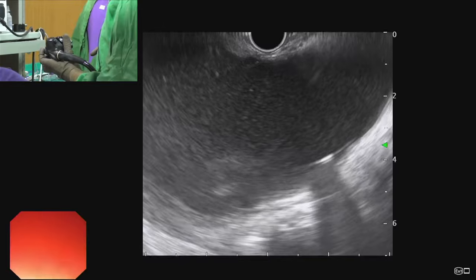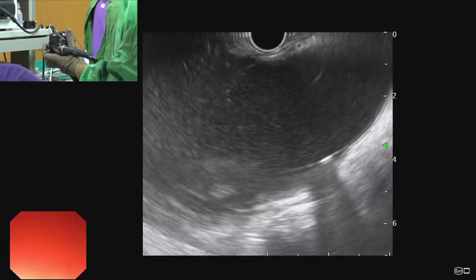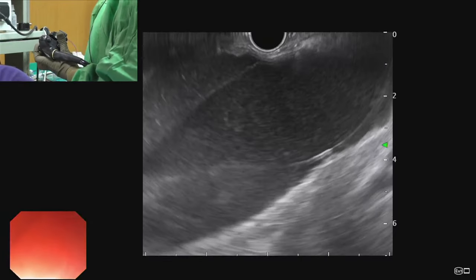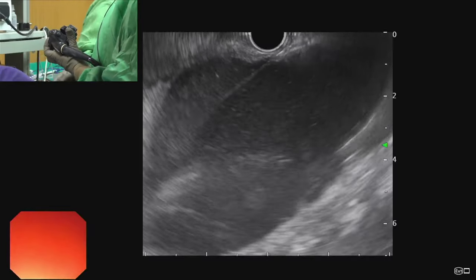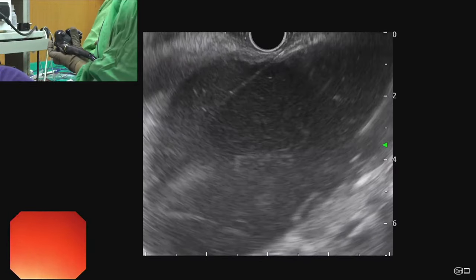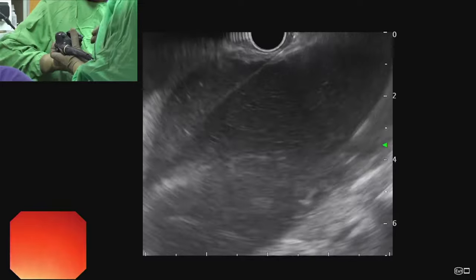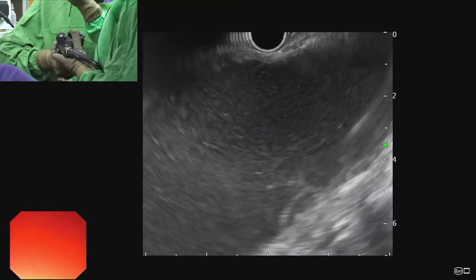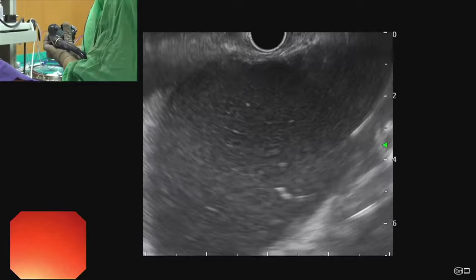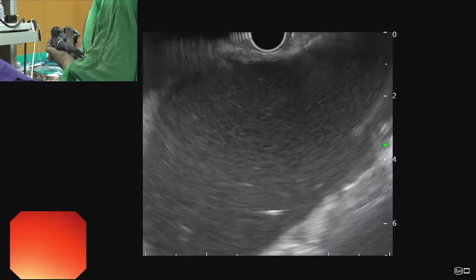The next step is placing a stent between the gastric lumen and the walled-off necrosis. The wire should be visible again under endosonographic vision, and over the wire we pass a catheter with the stent loaded over it. We can see we are pushing the catheter inside the fluid collection, confirmed under endosonographic vision.